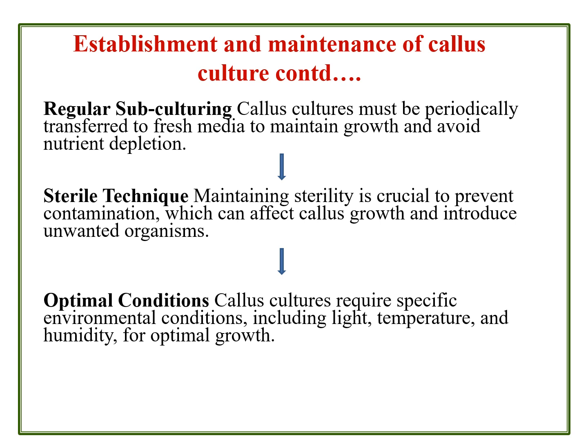Any cross contamination sometimes occurs because if any contaminated petri plate is not identified properly, all the petri plates in the culture maintenance room will be completely contaminated, and fungal spores can easily diffuse, even though they are sealed with paraffin film, and the fungal spores can readily establish their culture even after cooling the media to room temperature.